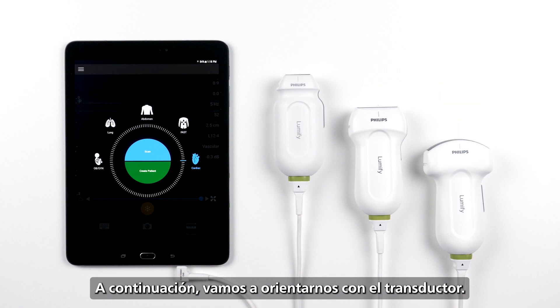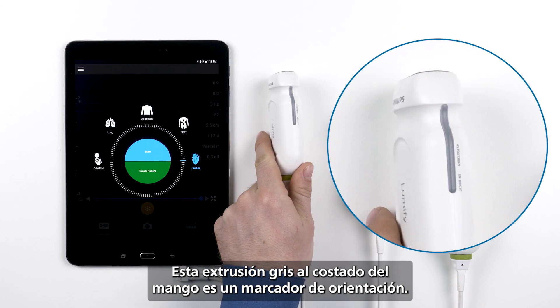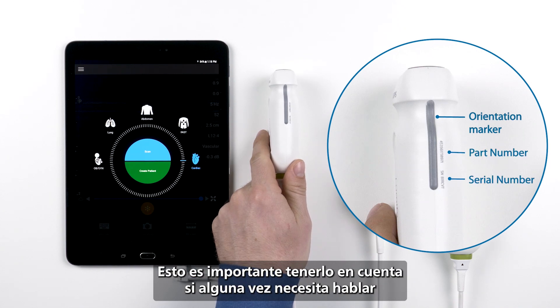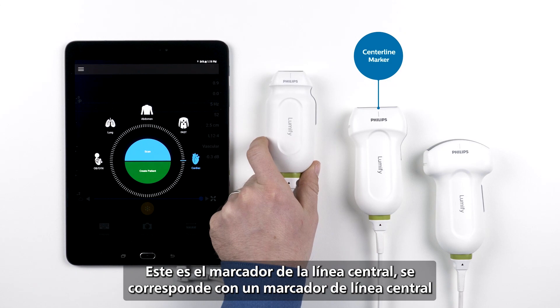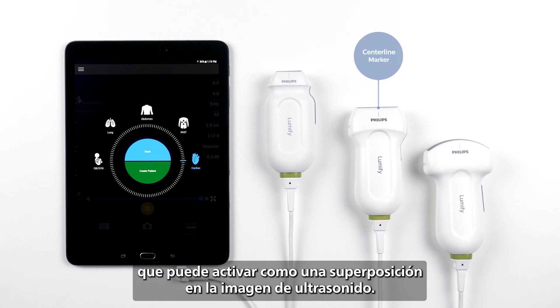Next, let's get oriented with the transducer. This grey extrusion on the side of the handle is your orientation marker. This corresponds with the orientation marker on the ultrasound image. Here, you will see the part number and serial numbers of your transducer — this will be important to know if you ever need to speak with your Philips service or account representatives. This is the centerline marker, and it corresponds with the centerline marker that you can activate as an overlay on your ultrasound image.